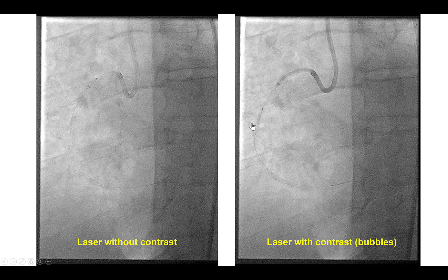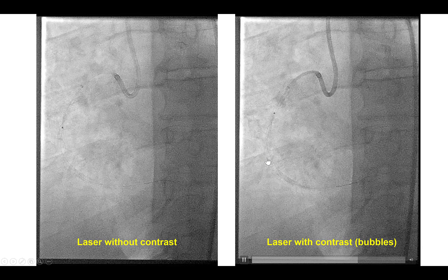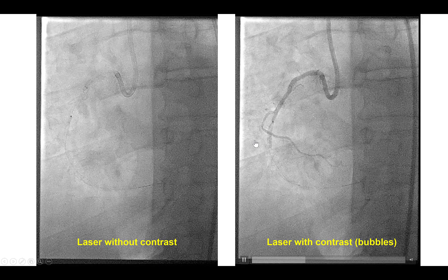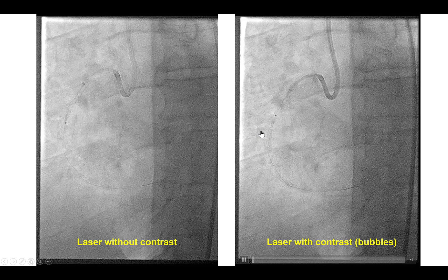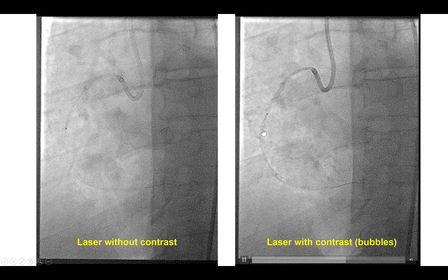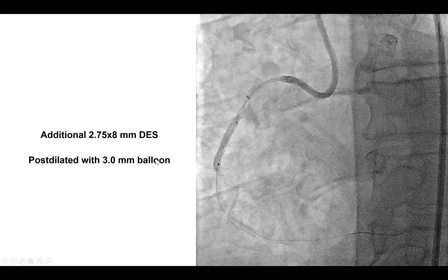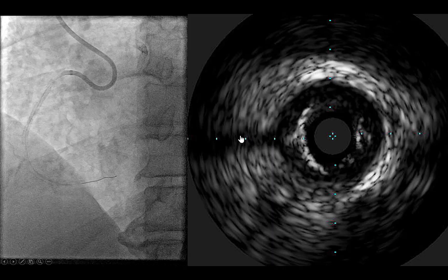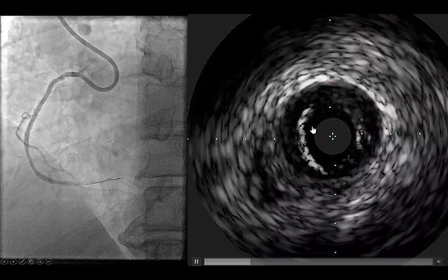So we went to the next step, which was laser with simultaneous contrast injection. We observed small bubbles forming distally in the vessel — this can happen in some cases like this, especially when flow is slow into the vessel. The patient was fairly stable and did not have any EKG changes or chest discomfort. After the laser, using a balloon we were actually able to expand the lesion successfully. The proximal part was treated with another stent, and with intravascular imaging we confirmed that an excellent result was achieved and the stent was well expanded.